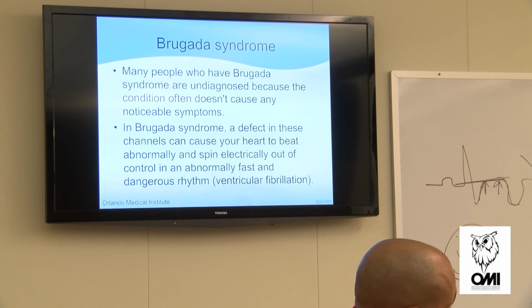So what is Brugada? Many people have Brugada syndrome undiagnosed and probably never know, unless you had a patient who stubbed his toe or banged his knee and something told you to do a 12 lead, and you did a 12 lead, boom, and you found it. But what's key with this is people with Brugada, if they have a syncope episode, they're probably going to code on you. So a syncope episode should warn you to do a 12 lead. If you see Brugada, Scotty, beam us up.